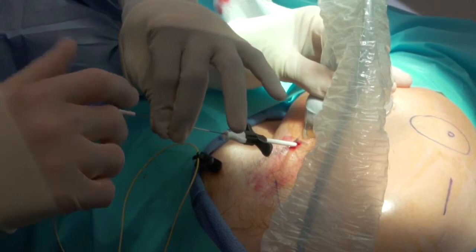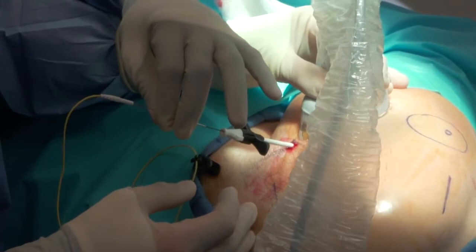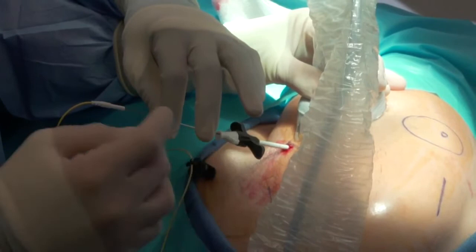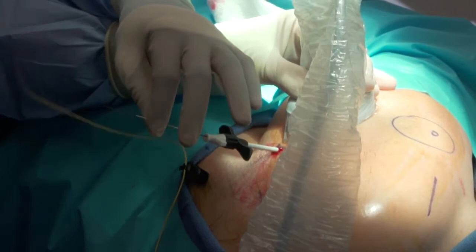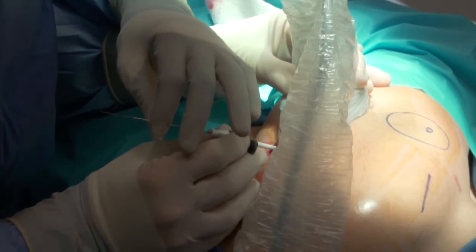Real good contraction there. Are you feeling that in your shoulder? My arm is jerking up and down. Okay. We'll come back a little. Right on it. Good. Perfect. All right. Hold that again, Michael. There's a nice contraction there. Okay. 0.5. Beautiful. And do we need to overshoot that dilator? That's where it is. It's right at the tip. So overshoot it just a little bit more. Perfect.